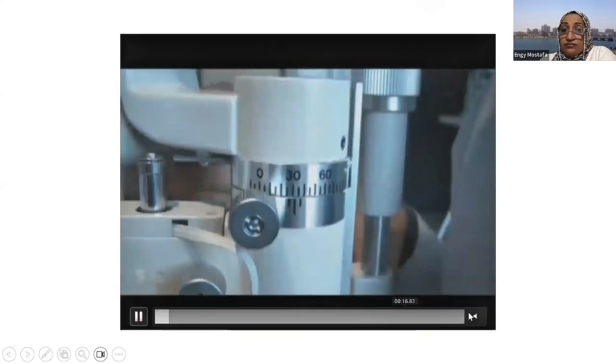So how do we do that? Now we are going to decrease the beam totally, like 1 by 1 millimeter. We are going to depend on something called the Tyndall phenomenon. You know, like when the sun comes in and passes through some dust, you start to see the dust particles when a sunbeam comes across. That's exactly what it is when we see the cell and flare in the anterior chamber.